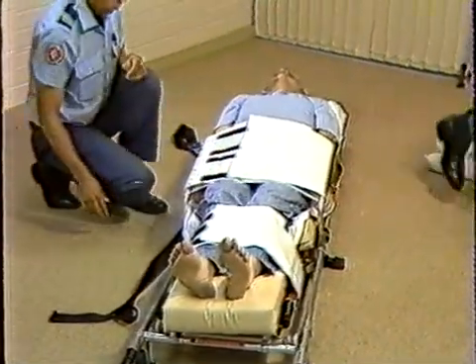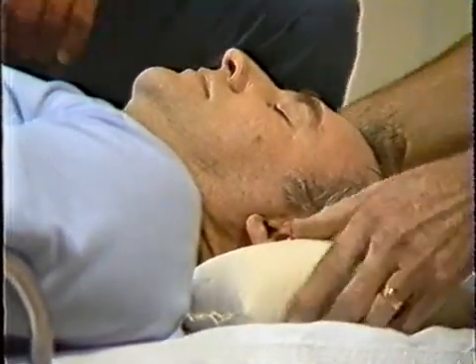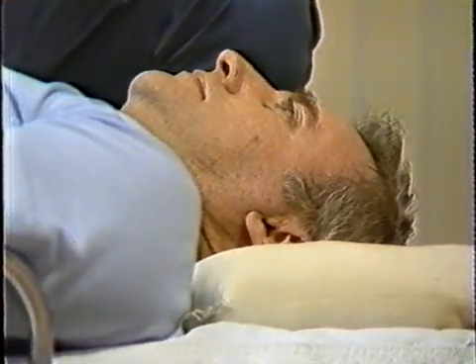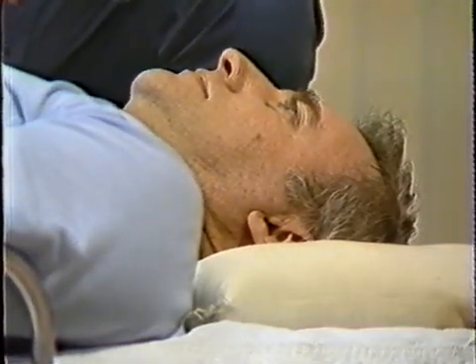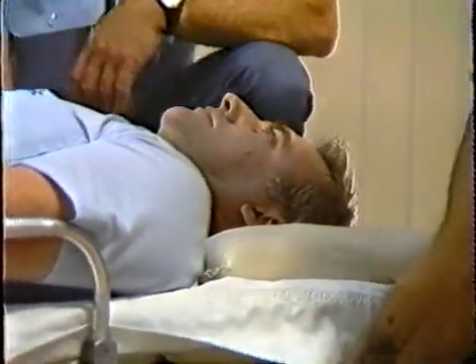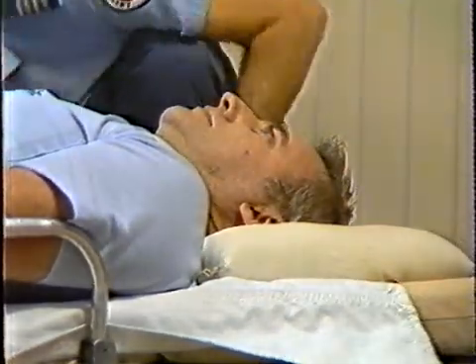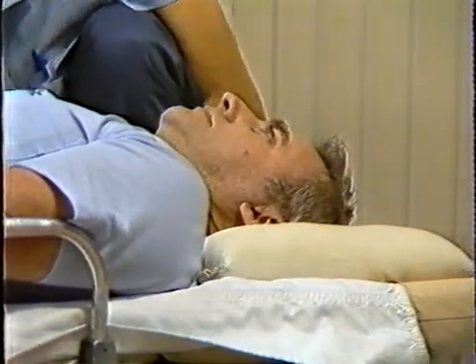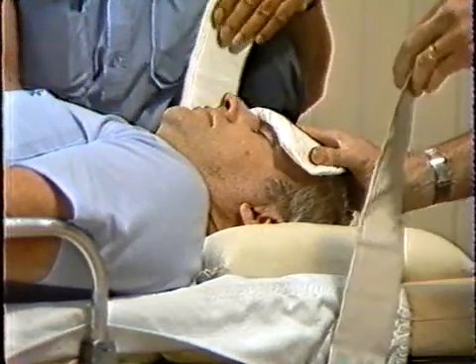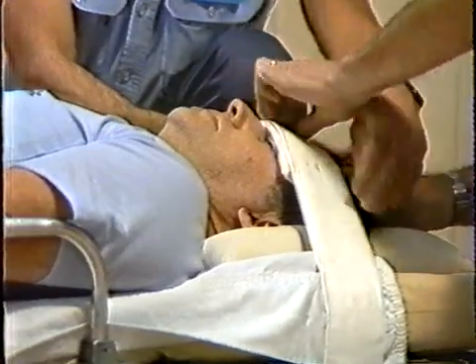And the last one, we'll support the head with 2 sandbags, which I prefer to do, even though there may not be a cervical injury. It helps support the head from wobbling around. Leading edge through, and get your offsider to take it through. And you can put a little bit of combine over the forehead and apply for the head.